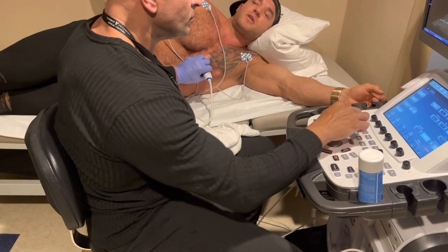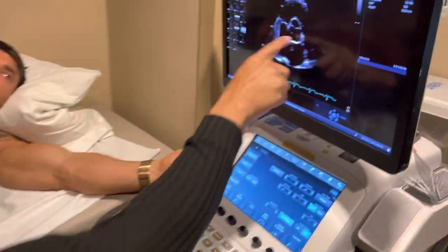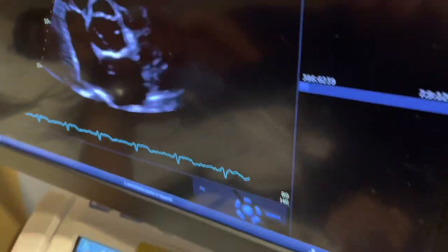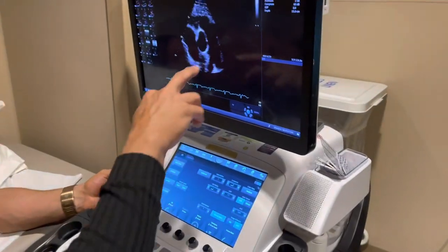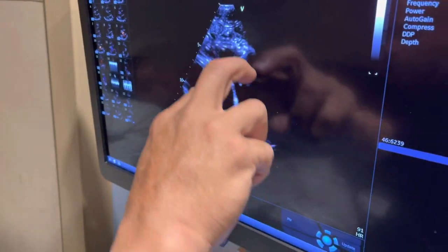So now we're looking at your aortic valve. I can see one, two, three leaflets — it's a normal valve. Here we can see the pulmonic valve again, and the branches of the pulmonary artery. This branch goes to the right lung, this one goes to the left lung.